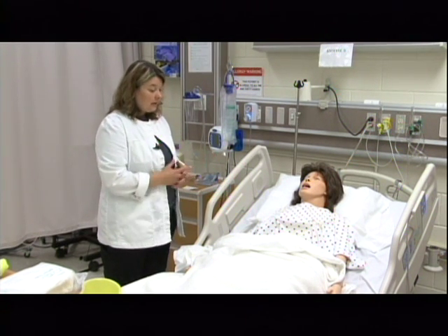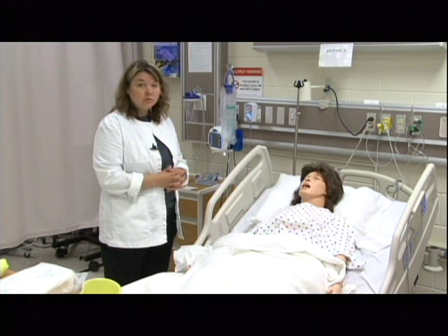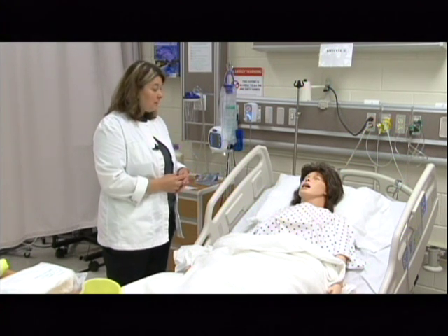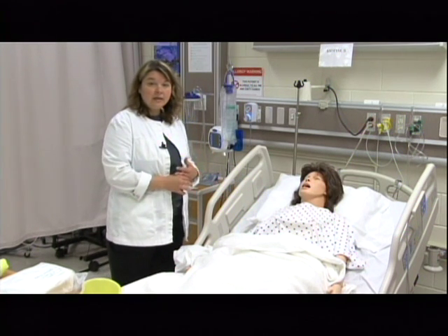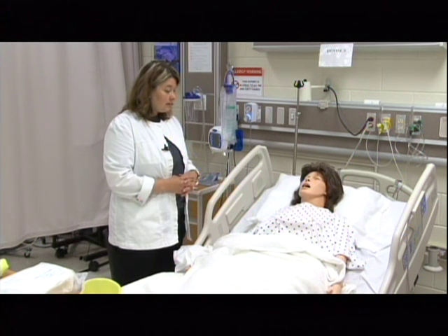As I'm doing this, I could do any patient education at this moment, and I could explain to her the purpose of the tube feeding. One reason the patient might end up having a gastric tube, it might be that they've had some type of throat surgery or mouth surgery. It could be that they're failure to thrive. They're having issues with weight gain. Maybe they have some type of cancer, gastric issues, some of those kind of things.